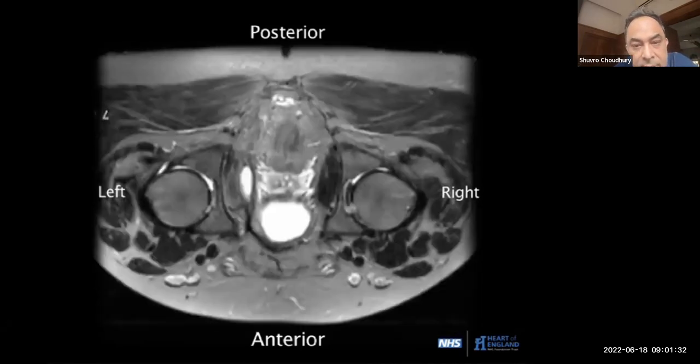Okay. So, Madam Banerjee, this is the bladder. This is the obturator internus on the side. This is the sacrum, or the lower sacrum and the coccyx. This is obviously the acetabulum on two sides. And here is the abnormal tract. Okay, this is the fistula tract.